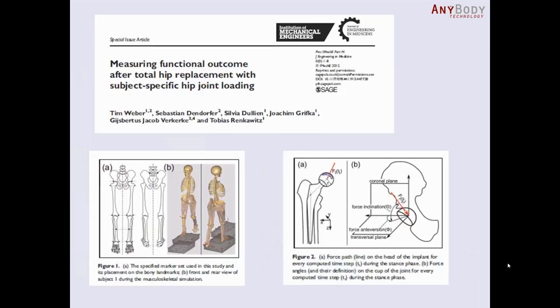Another study, recently published or accepted from a group from Germany, shows that you can analyze hip replacements with subject-specific hip joint loading.